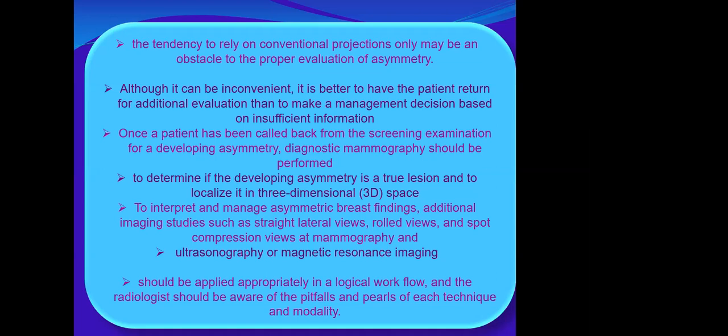a real lesion, or it might be a focal asymmetry also. So, although it can be inconvenient, if you see that on screening mammography, just recall your patients, okay? Recall the patients and base your management on sufficient information. Don't take it lightly.